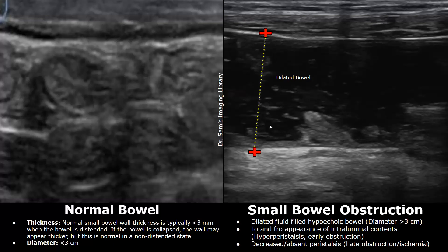In early obstruction, you may find hyperperistalsis. On real-time imaging, a to-and-fro appearance of the intraluminal contents is seen. The intestinal contents moving to and fro indicate hyperperistalsis — an increased peristaltic movement usually seen in early obstruction.